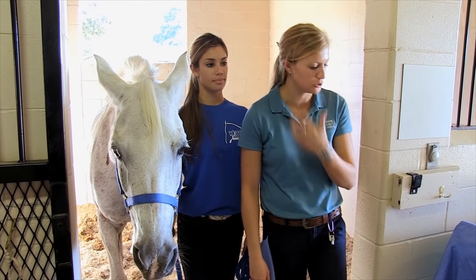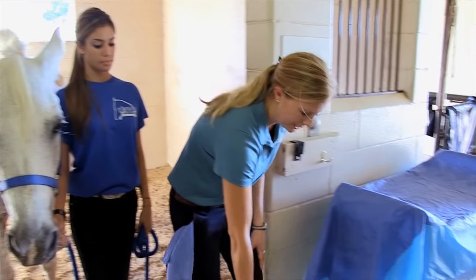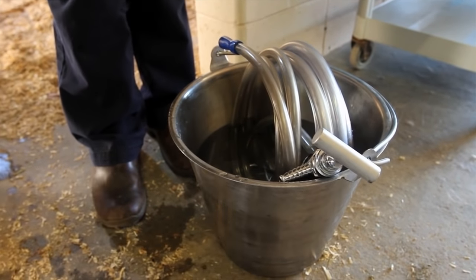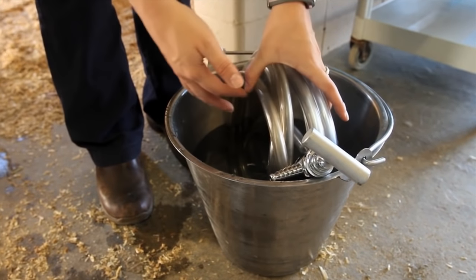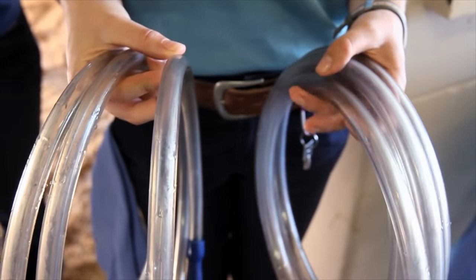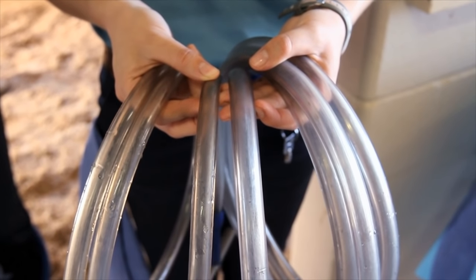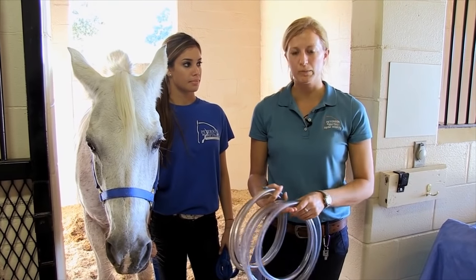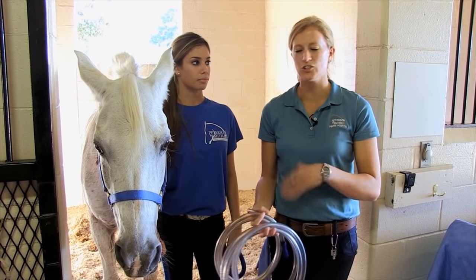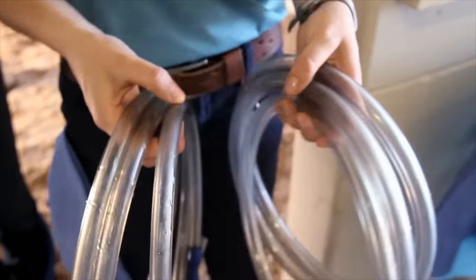We have a couple of different types and sizes of tubes. I keep them in my bucket in water — it softens them up a little bit and makes them easier to pass. Here I have two different sizes: a medium tube and a large tube. I typically use the large tube if it's the first time I'm seeing a colicking horse because it's easier to lavage anything out of their stomach. For demonstration purposes today I'm just going to use the medium tube.